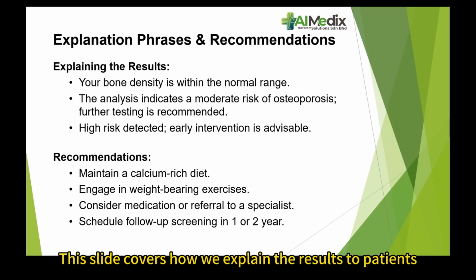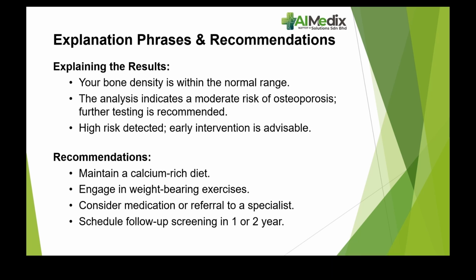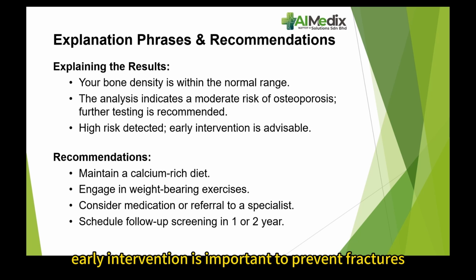This slide covers how we explain the results to the patient and what action we recommend to take. If the bone density is normal, we reassure the patient. If there's a moderate risk, we recommend further testing like a DEXA scan. If the risk is high, early intervention is important to prevent fractures.